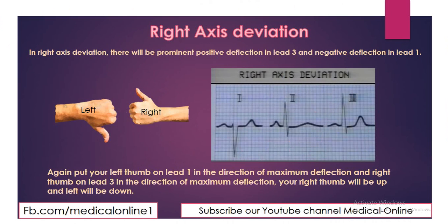In Right Axis Deviation, there is a prominent positive deflection in Lead 3 and a negative deflection in Lead 1. We put our left thumb on Lead 1 and right thumb on Lead 3 in the direction of prominent deflection. In this case, our right thumb is up and left thumb is down, indicating Right Axis Deviation.